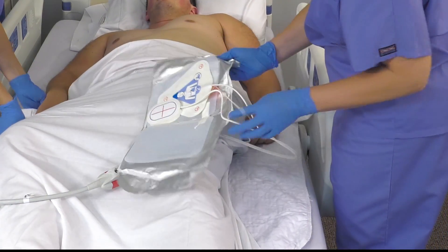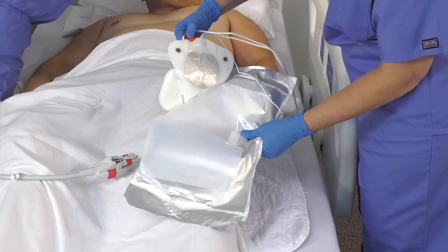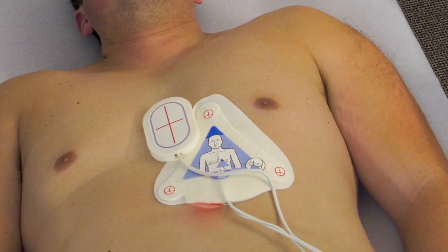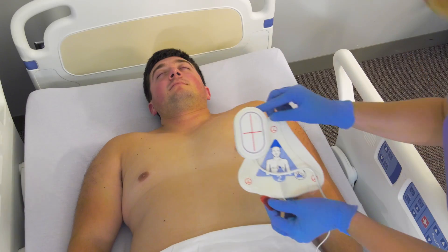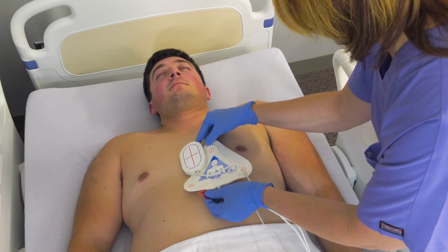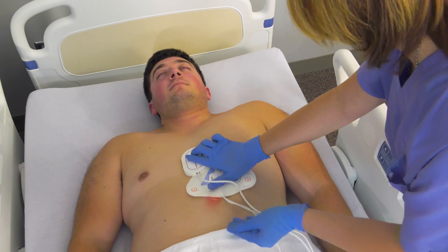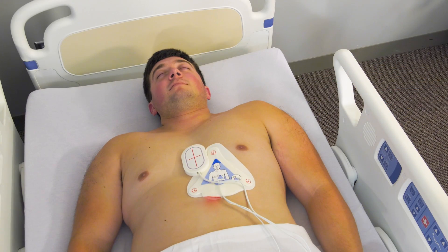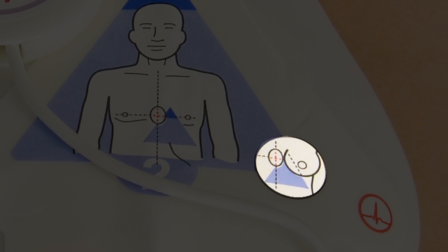To apply the front electrode, grasp the triangular blue electrode labeled 2 and peel it from the liner by lifting at the red tab at the base of the electrode. The one-step complete and one-step CPR electrodes include a CPR compression sensor. Place the sensor on the patient's chest so the vertical red line is mid-sternum and the horizontal red line is between the patient's nipples. Roll the electrode onto the patient's left chest with the blue triangle midway between the sternum and nipple. For female patients, lift up the breast if necessary in order to position the electrode underneath.